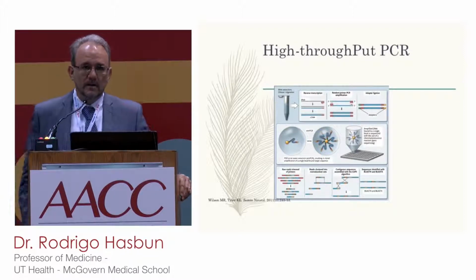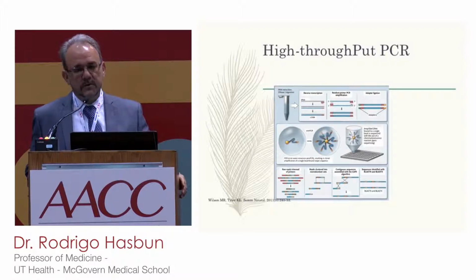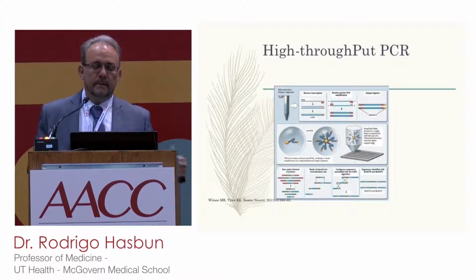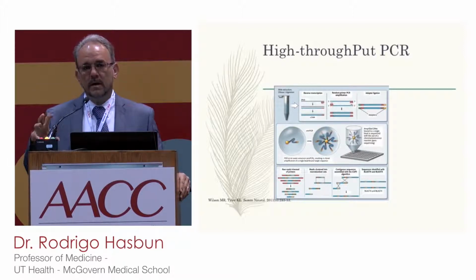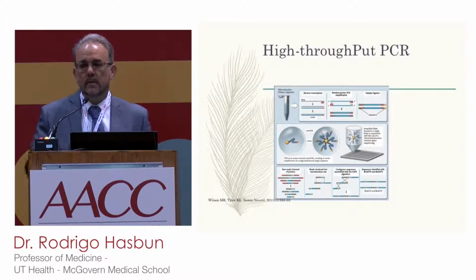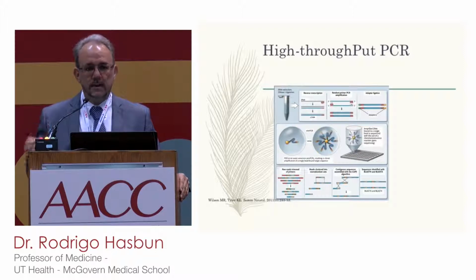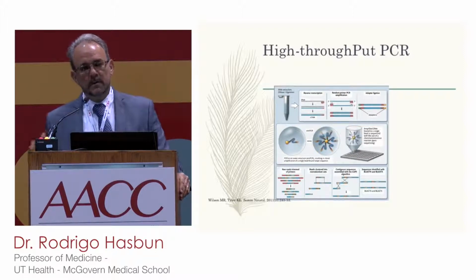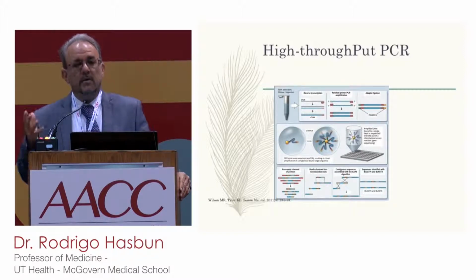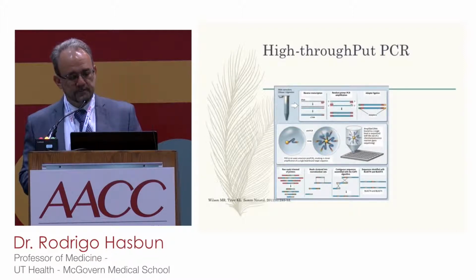And this is another technology that I think could change the outcomes of our patients in the future. It's high throughput PCR, or next generation sequencing, where you basically get the genetic material from the sample and do a BLAST analysis where you can corroborate the genomic sequencing of what you find in the sample with the NIH database to tell you what virus, bacteria, fungal, TB pathogen you're looking at with high degree of confidence. So it will tell you it's a 99.8 concordance with an astrovirus. And it can actually detect new pathogens. So it's a new pathogen discovery tool.